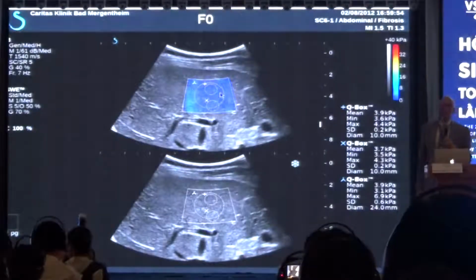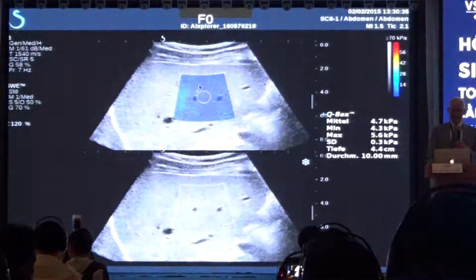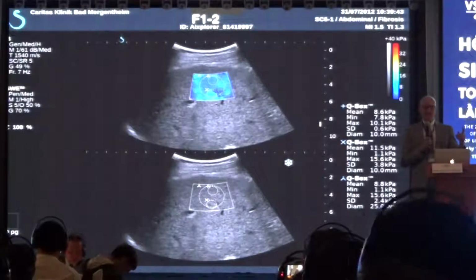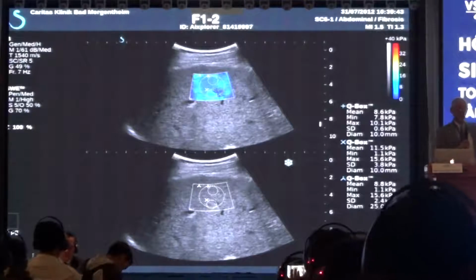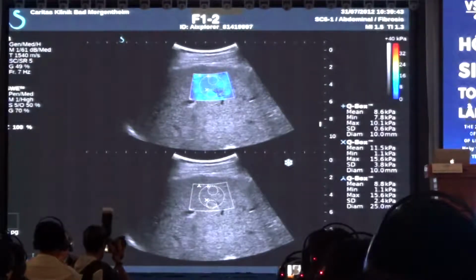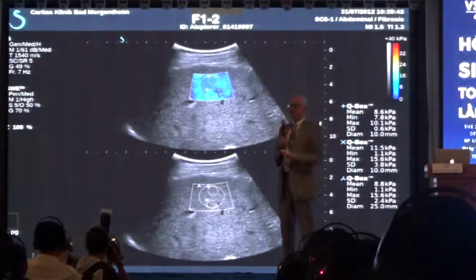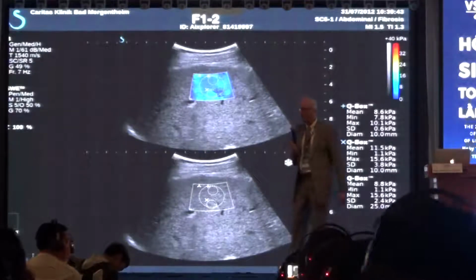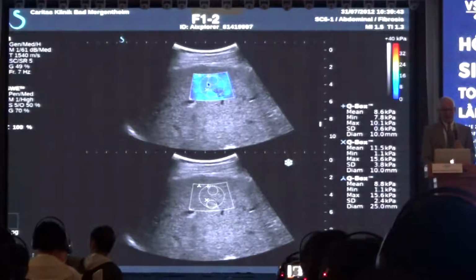If we look for no fibrosis, F0, you have that blue, and you have a homogeneous tissue. One take-home message: the quality parameter is very good in healthy livers for almost all systems. There's almost no error. The higher the fibrosis, the more heterogeneous the liver parenchyma, and the higher the natural error of your results, because the liver is heterogeneous and gives you different values. So intermediate range, a little bit more heterogeneous.